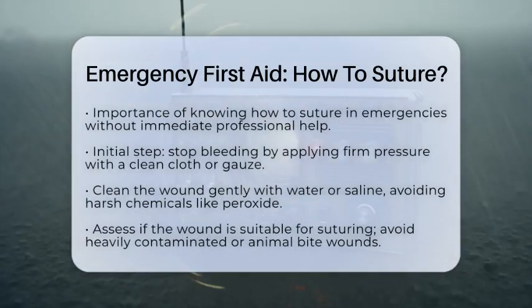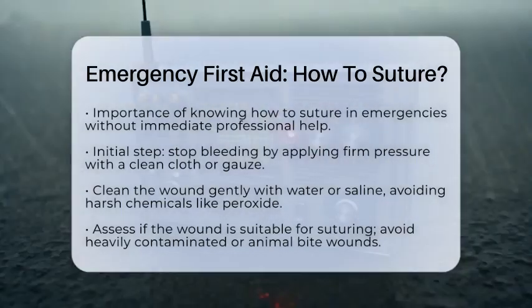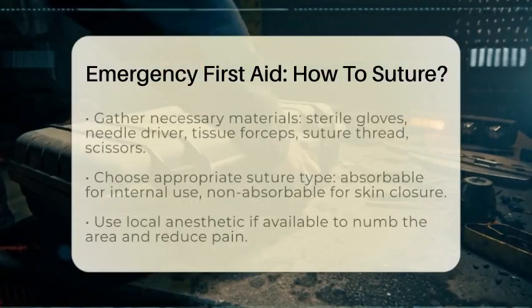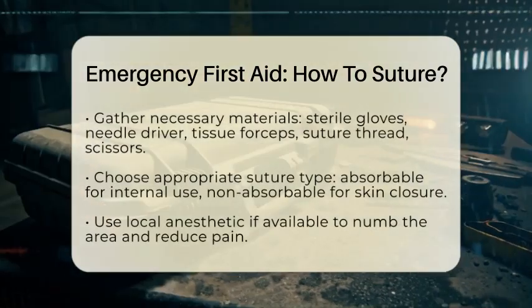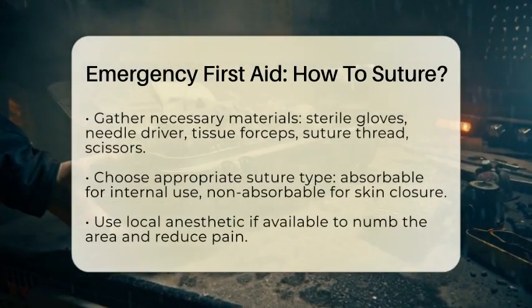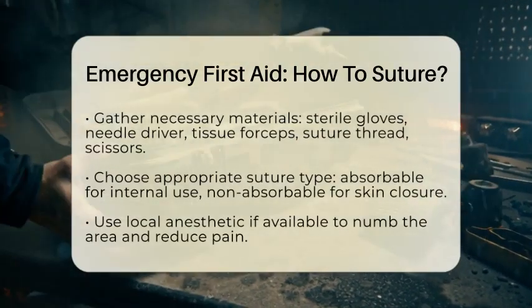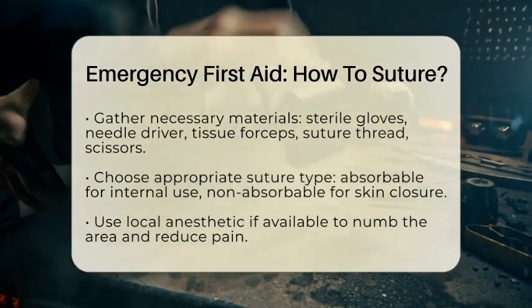Check if the wound is suitable for suturing. If it's heavily contaminated, a puncture wound, or involves animal bites, it's better to wait for professional help. Gather your materials next. Wear sterile gloves to reduce infection risk. Prepare a needle driver, which is a small tool to hold the needle, tissue forceps to handle tissue gently, sterile suture thread, and scissors to cut the thread.